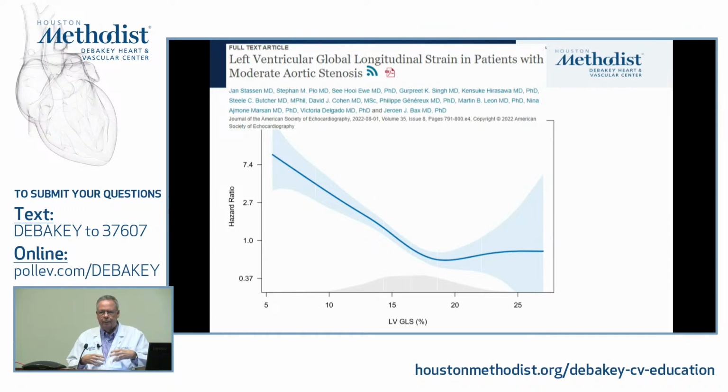Now, these people, I'm sure, had all kinds of combinations. These people had hypertension, elderly. I mean, there's a mixture of things here. This is not just aortic stenosis by itself. The point, however, is the power of GLS in predicting outcome.